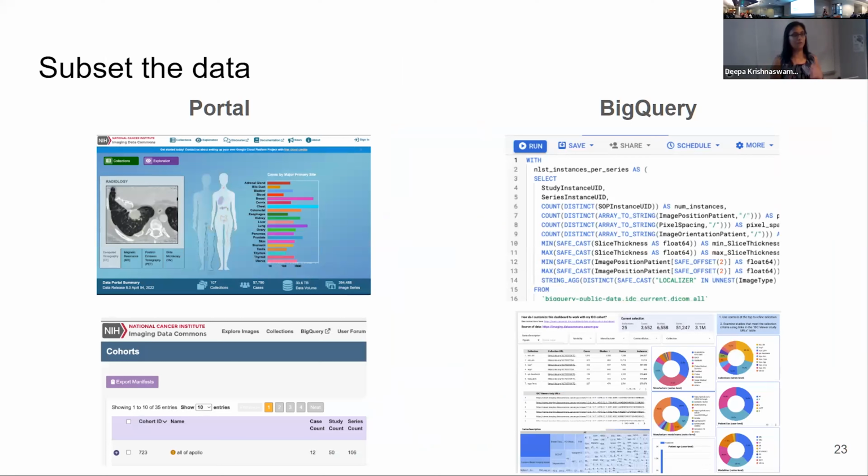So what happens is you have all this DICOM data and we can extract different types of metadata from that. So for instance, what type of modality is it? How many slices are in here? What's the pixel spacing in each of the X, Y, and Z directions? And you can use all of this information to then filter and query out the data set that you need.